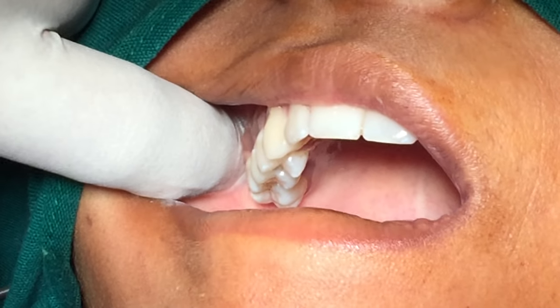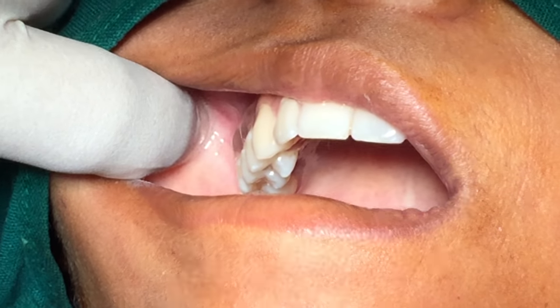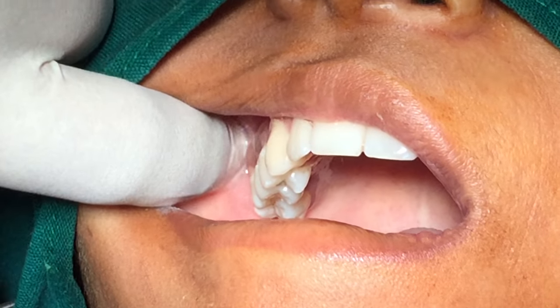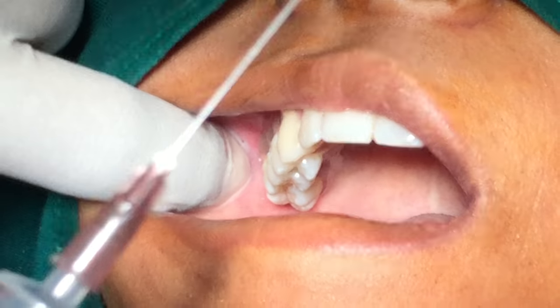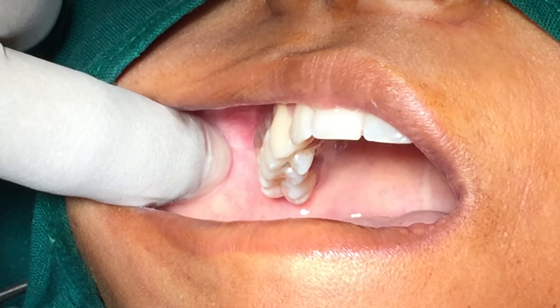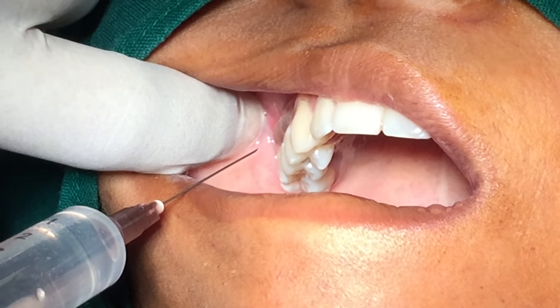For this block, a 25 gauge needle is used. The area of insertion is the height of the mucobuccal fold above the maxillary second molar.